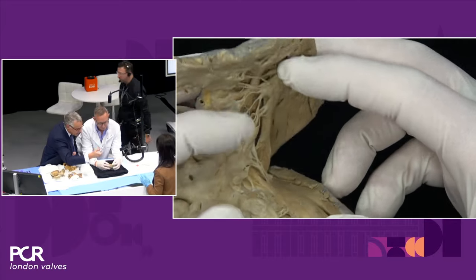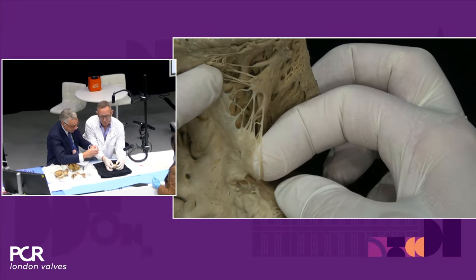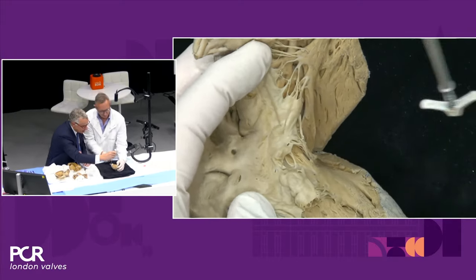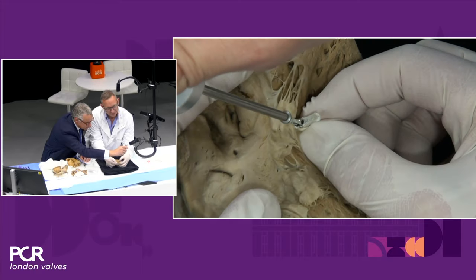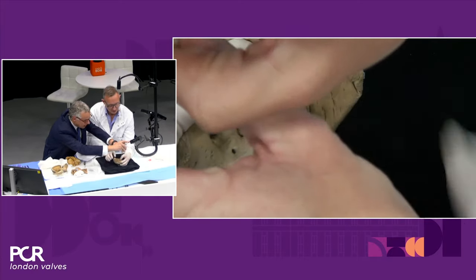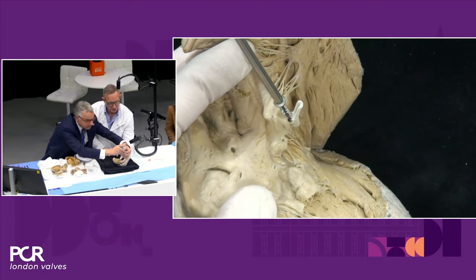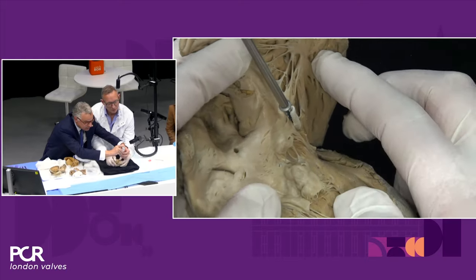So, is it a tricuspid or a mitral? This is tricuspid. Tricuspid, sorry, I don't know exactly the anatomy. So, I will grasp here the anterior, correct? And I need to drop the grippers like this. There you go. And then I close the clip.